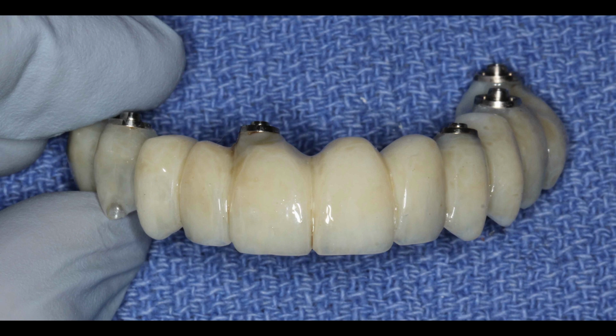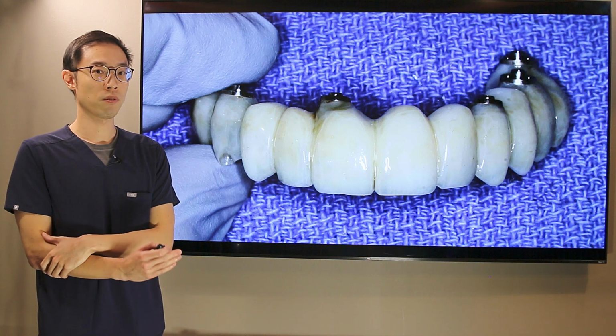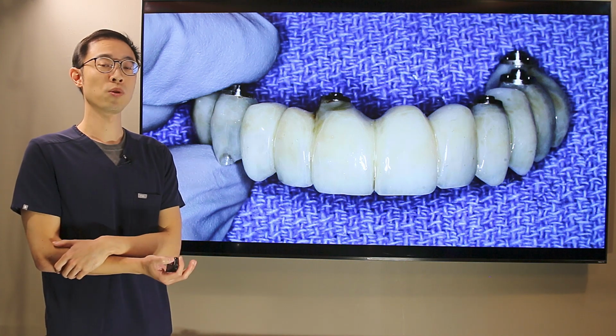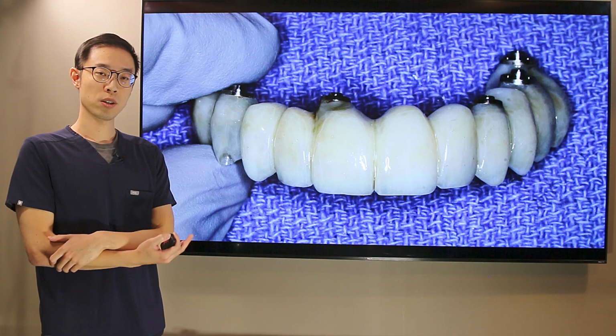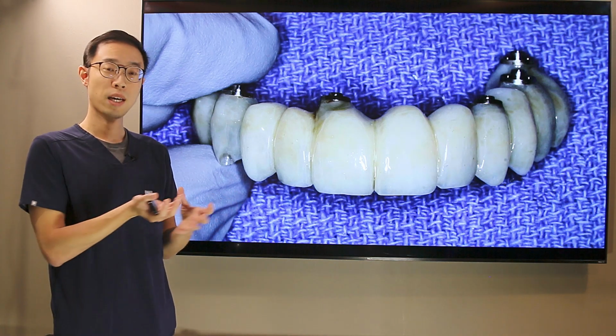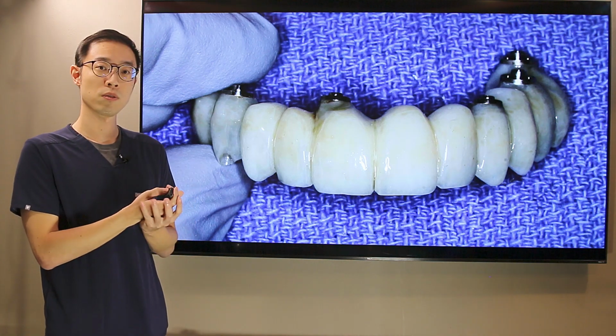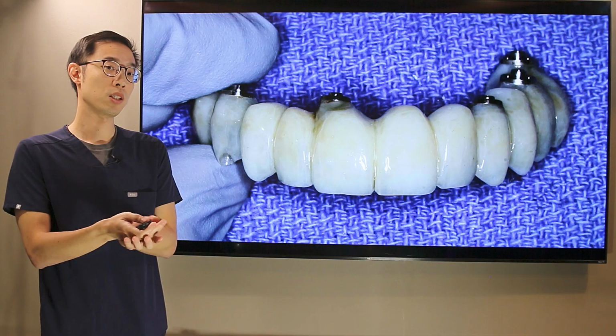Like I mentioned, we like to provide our patients with fixed provisionals if at all possible. In this case, you can see the provisional that we made connected to the implants. I want you to pay special attention to the tissue side of the provisional. This area has to be hand sculpted very meticulously to be convex, smooth, and rounded. The reason why is because this stage is the perfect time when we insert this to provide a scaffold for the tissues to heal nicely around. This is really important for affecting the later stages, which you will see.